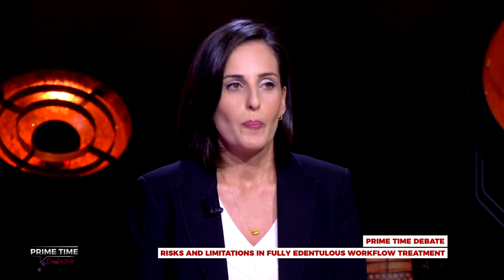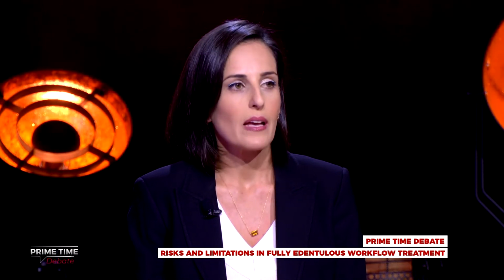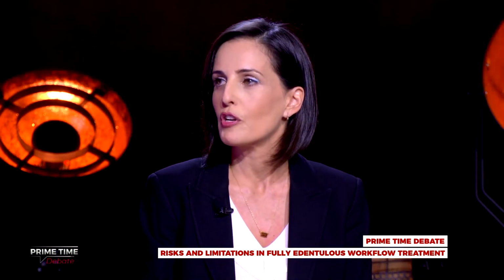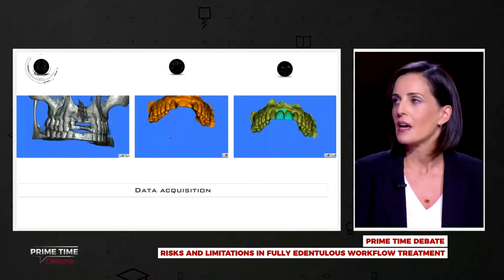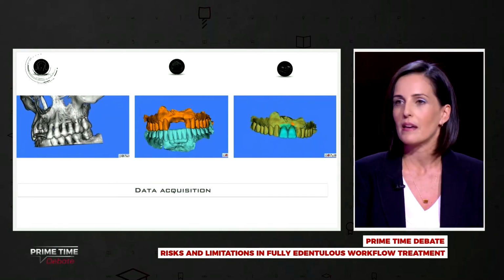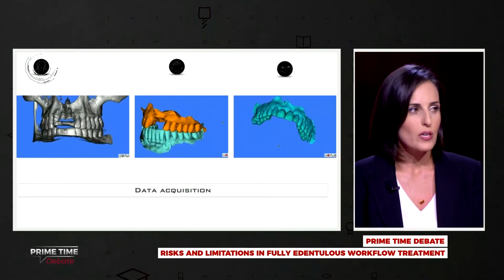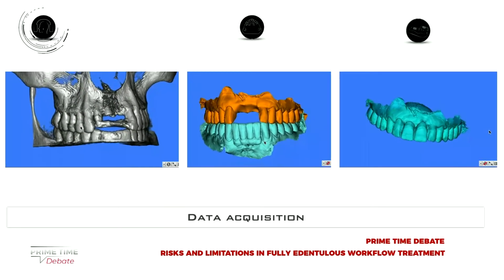We want to plan a guided implant surgery. So we need to create our treatment plan. For that, we have to make a digital file on the software in a reliable way. So we would first need to have the CT scan of the patient. We would like to have a model of the patient that will be taken either with an intraoral scanner or in a conventional way, and then casted and scanned to an STL file. And of course, we have to know also the destination, where we want to be. And that will be our wax up.